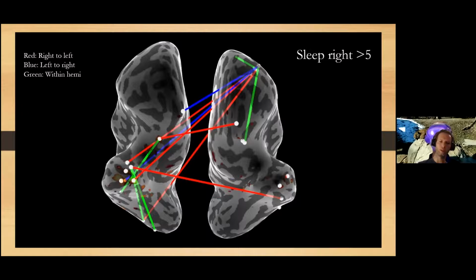And no other method or modality could capture or give us some understanding why she's getting this kind of auras, because we couldn't detect any epileptic activity in the occipital lobe. And this connectivity method was the only one that helped us to understand why she got this aura. So again, in the left.